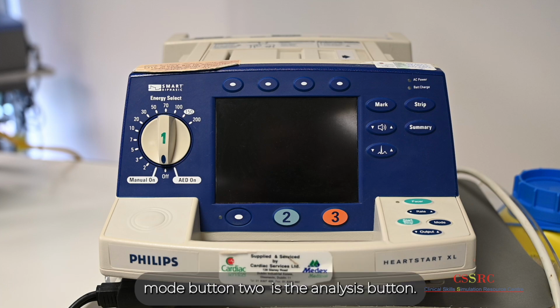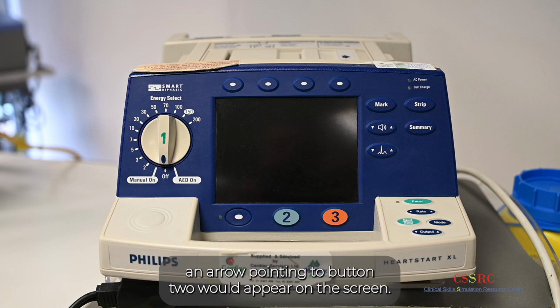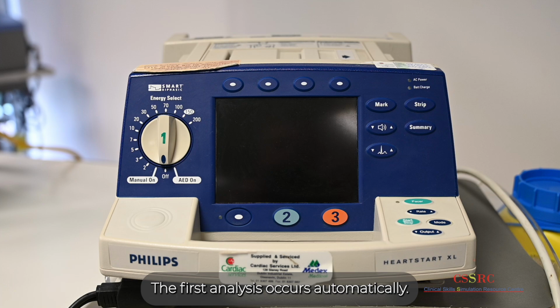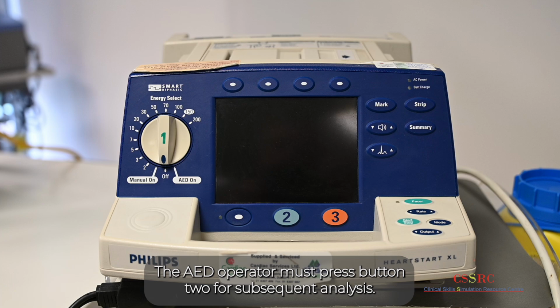Button 2 is the analysis button. When the pads are attached, an arrow pointing to button 2 will appear on the screen. The first analysis occurs automatically. The AED operator must follow the prompts and clear the patient. The AED operator must press button 2 for subsequent analysis.